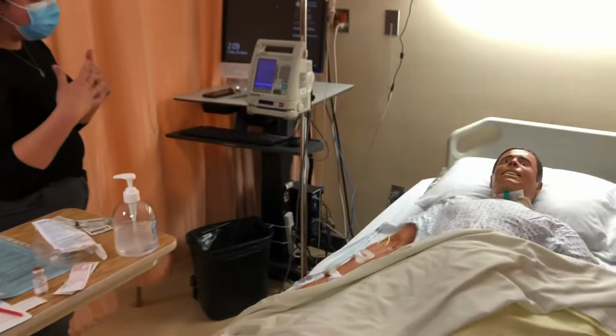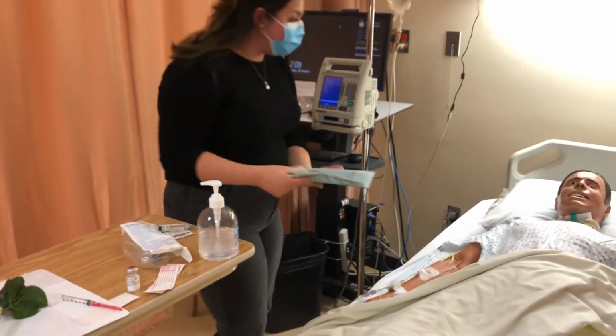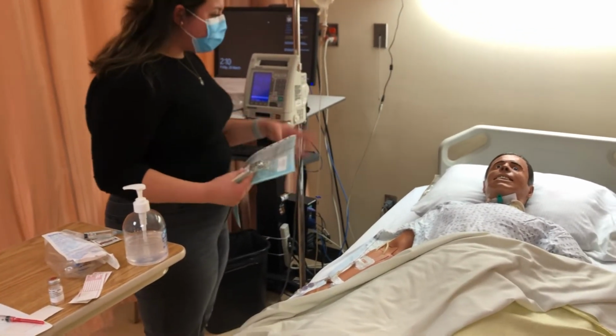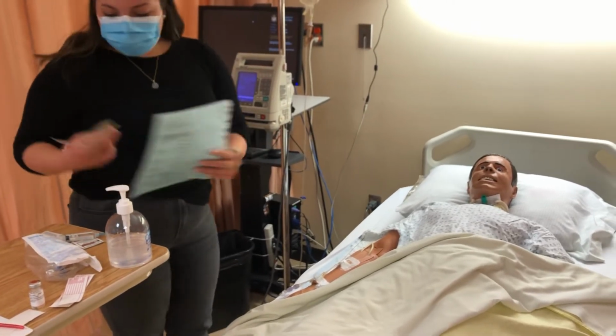Hello, my name is Kaylee. I'm going to be your student nurse today. I'm here to give you an insulin infusion. The doctor has ordered an insulin infusion for your high blood glucose so that we can control your blood sugars and your diabetes while you're here.